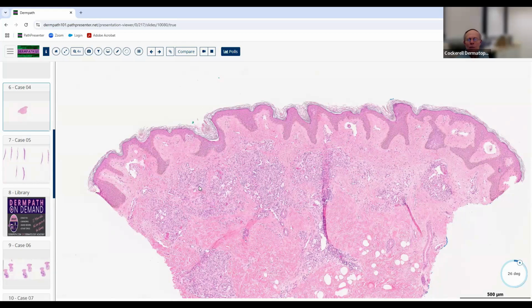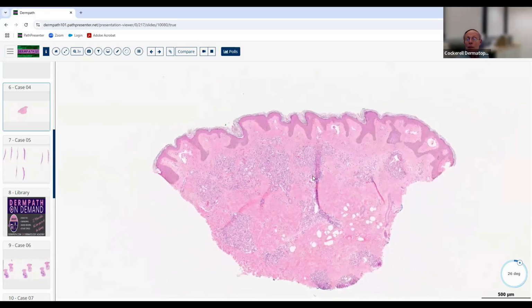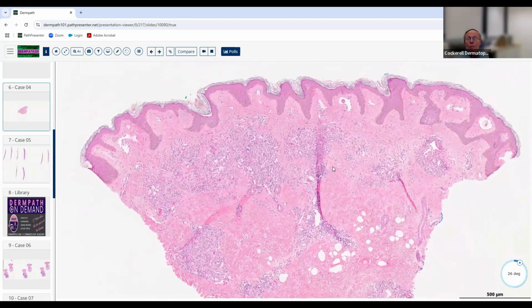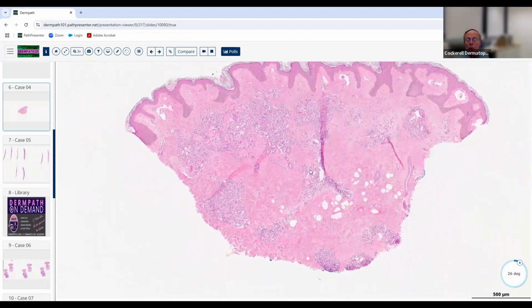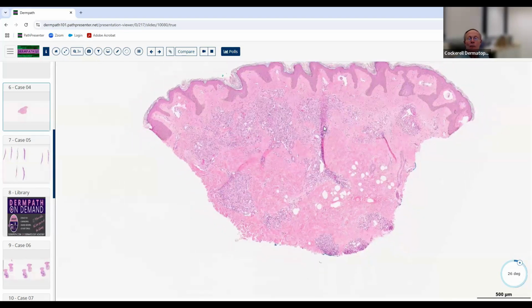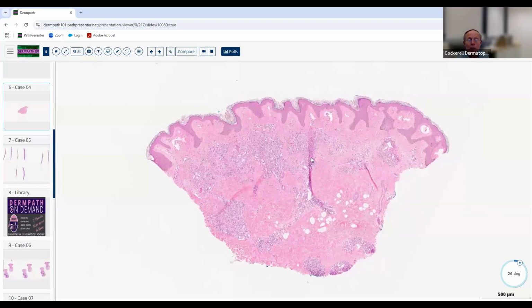So we say, well, it's vascular, so it's either a vascular proliferation, like maybe a pyogenic granuloma, or maybe severe stasis dermatitis with acroangiodermatitis, for example, or maybe it's a vascular neoplasm. And if it's a vascular neoplasm, then we have to ask ourselves, obviously, if it's benign or malignant. And so can we apply our criteria? Well, we can assess the breadth, the symmetry, the circumscription very well because we've got a punch biopsy out of probably something that was larger.